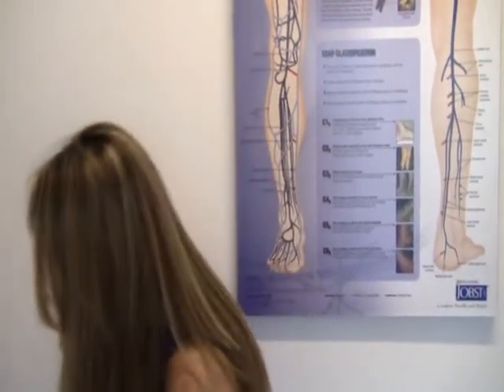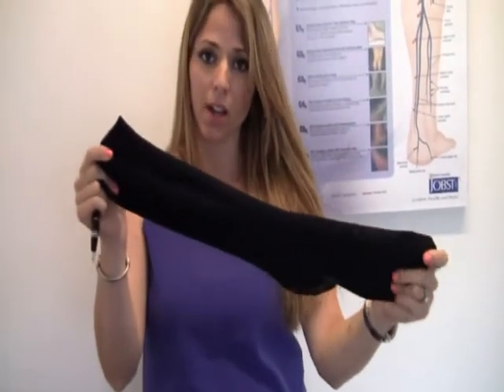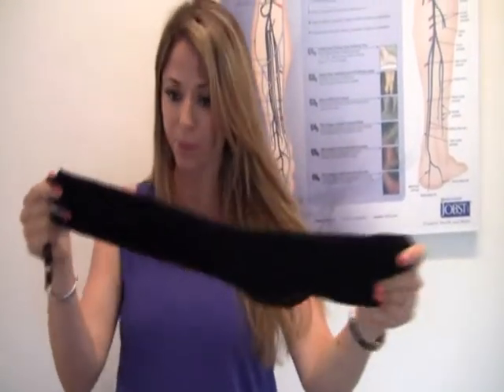The treatment of varicose veins can be conservative with compression stockings or surgical. These here are compression stockings. They are elastic. They come in a variety of colors and sizes.